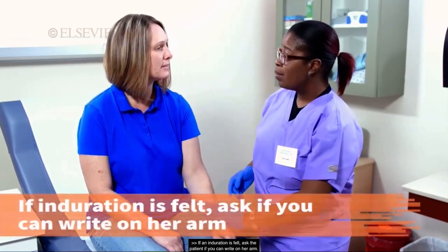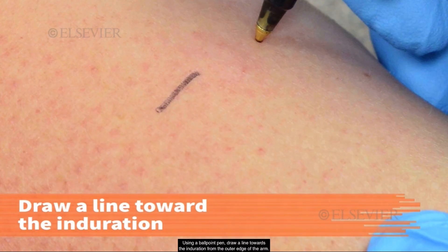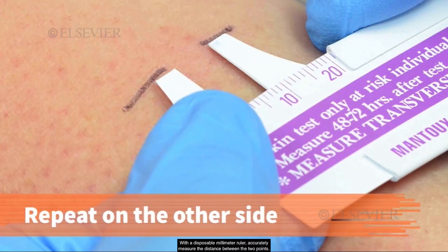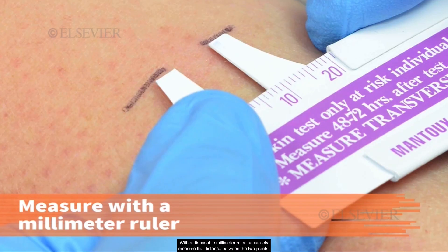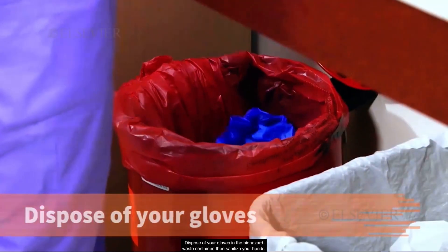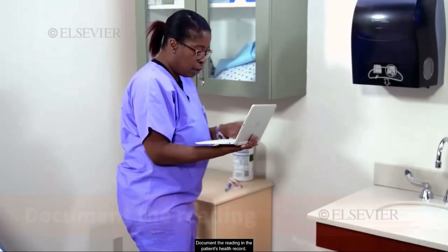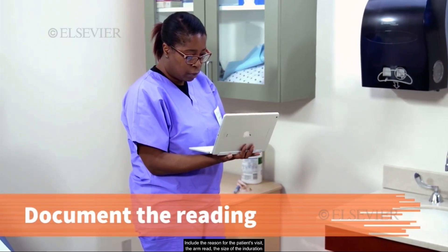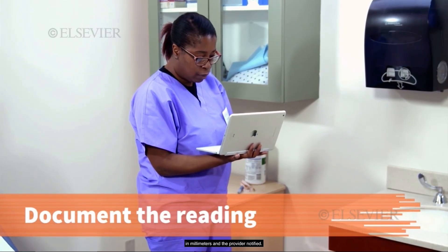If an induration is felt, ask the patient if you can write on her arm. Using a ballpoint pen, draw a line towards the induration from the outer edge of the arm. Repeat on the other side. With a disposable millimeter ruler, accurately measure the distance between the two points. Dispose of your gloves in the biohazard waste container, then sanitize your hands. Document the reading in the patient's health record, including the reason for the patient's visit, the arm read, the size of the induration in millimeters, and the provider notified.